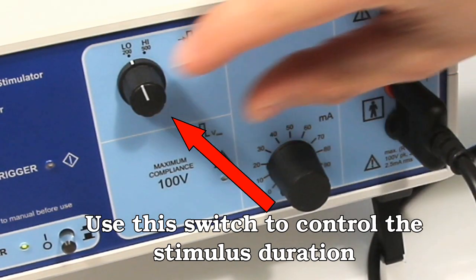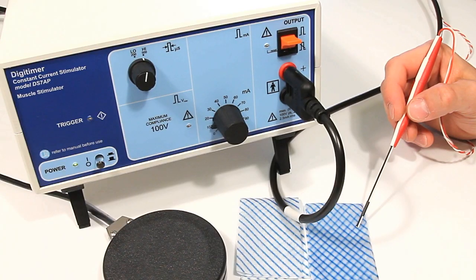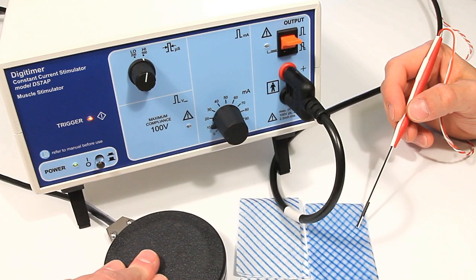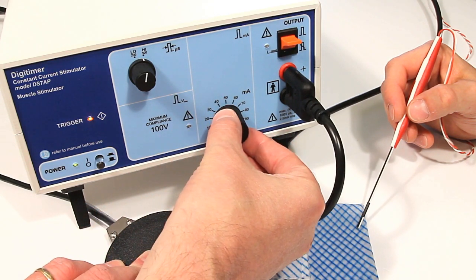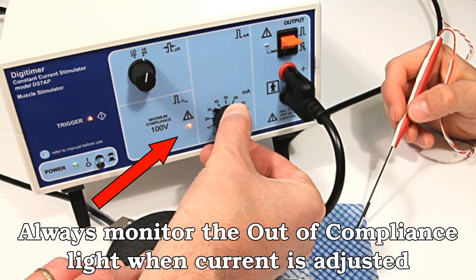If stronger stimulation is required, this can be achieved either by increasing the pulse duration to 500 microseconds or by increasing the current amplitude. However, it is important to monitor the out of compliance LED during increases of current, as they will have no effect while the stimulator is out of compliance.